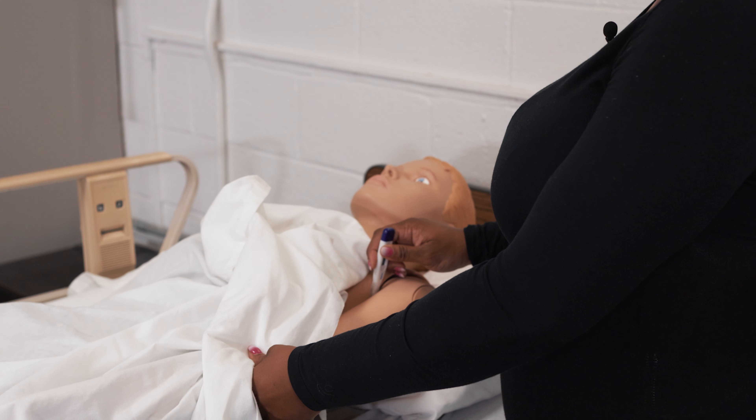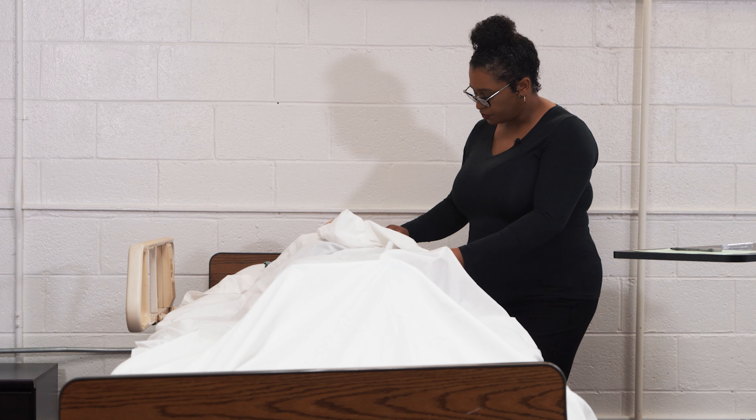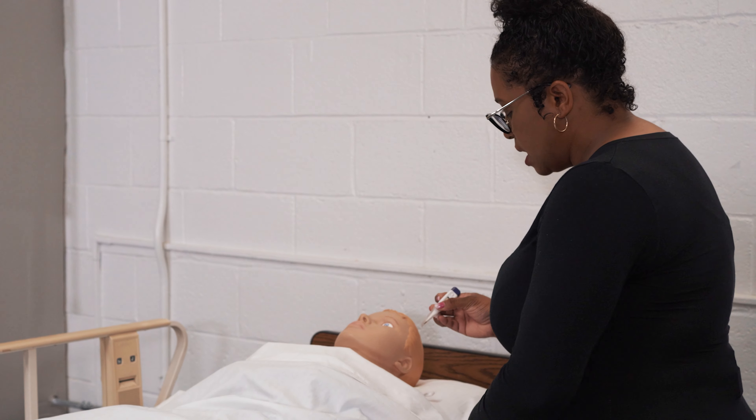We're going to leave the thermometer in place until we hear a beeping sound, which indicates that the temperature reading is complete. We're going to take out the thermometer and read the reading that is on the screen.